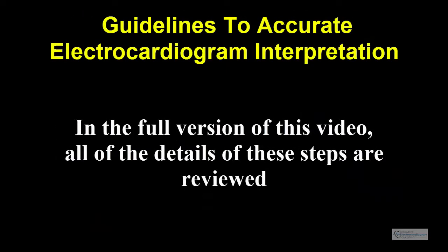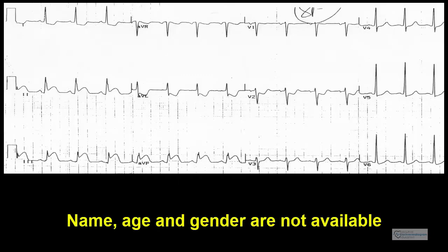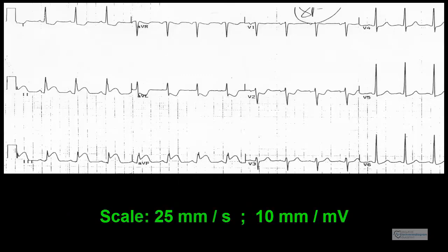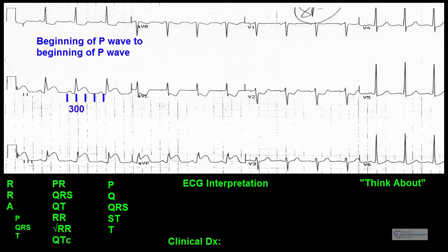During the full version, all of the details of these steps are reviewed. Now I will apply these steps to reading this electrocardiogram. The name, age, and gender are not available. The scale, as indicated by these boxes on the left, reflects a normal scale of 25 millimeters per second and 10 millimeters per millivolt. Using the 300, 150, 100, 75 method, the rate is between 75 and 100 beats per minute — we will say about 85 beats per minute.